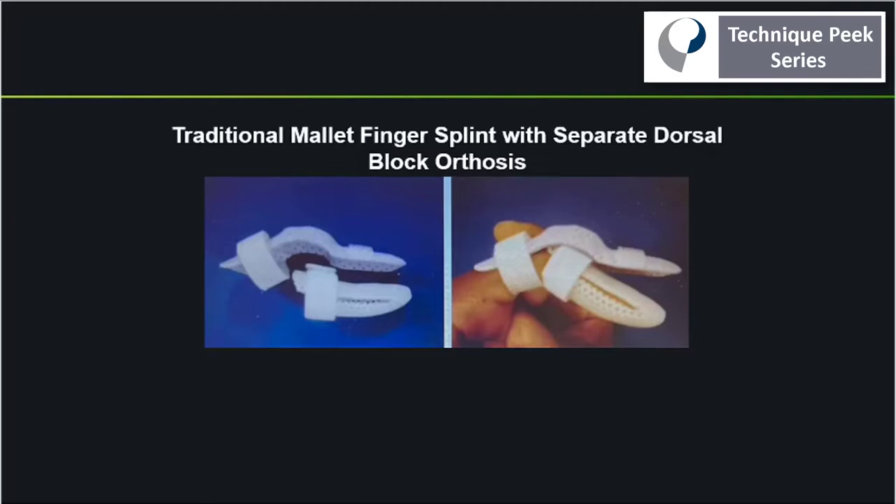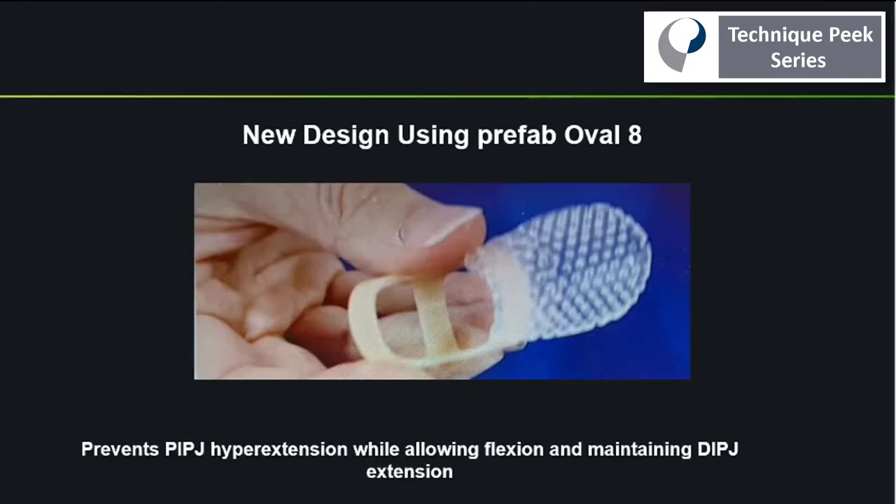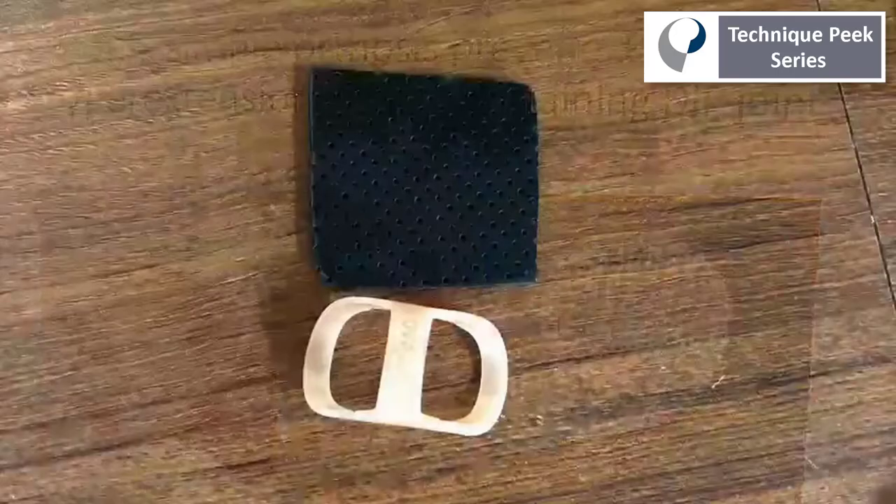Today we're going to compare the traditional mallet finger splint with separate dorsal block orthoses to a new design using a prefab oval 8. This design will allow for PIP joint flexion but prevent hyperextension, while still maintaining DIP joint extension.